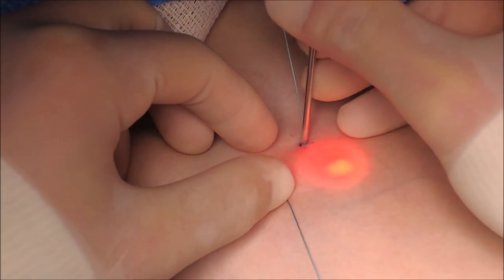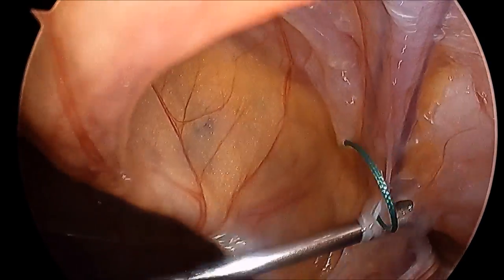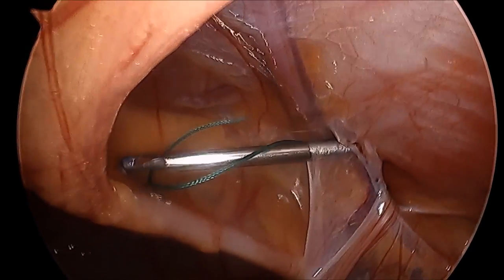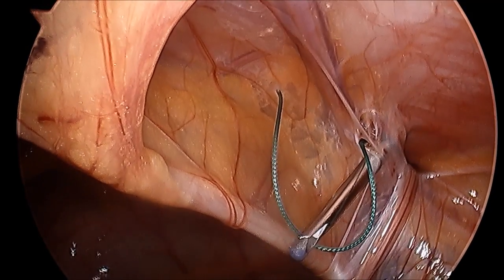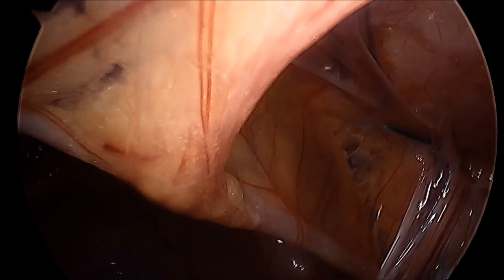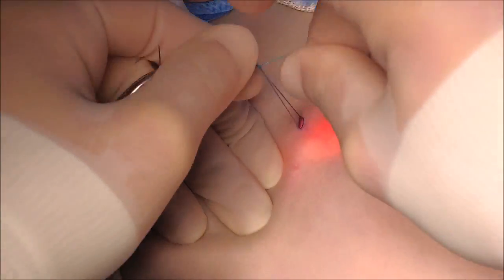Using the endoclose needle, the tip of the camera can be used to pull the suture out into the abdomen. When tying the knot, the air on the labia is squeezed by the assistant.